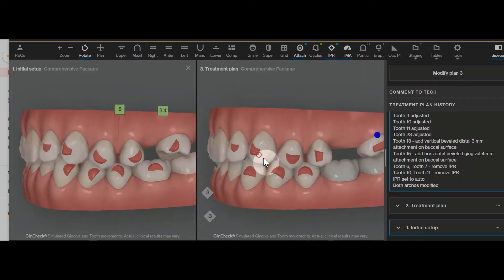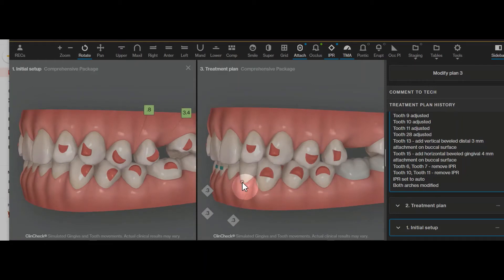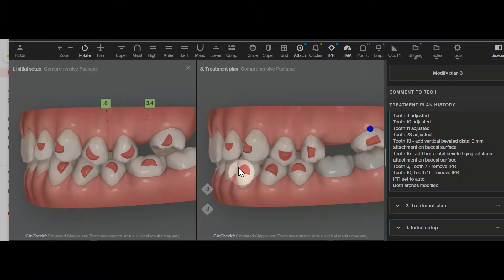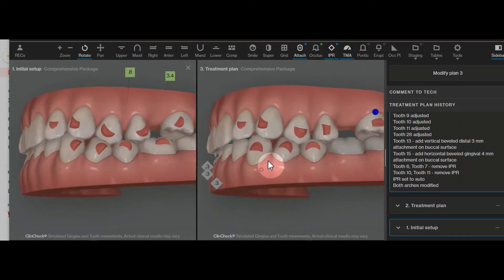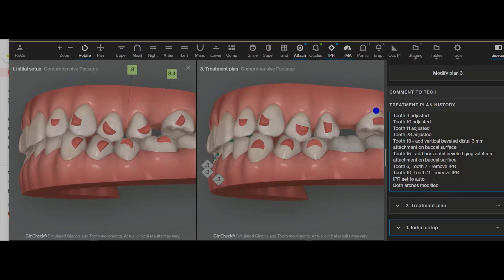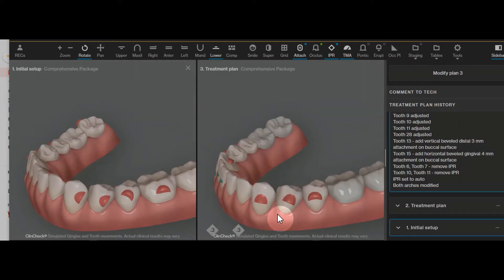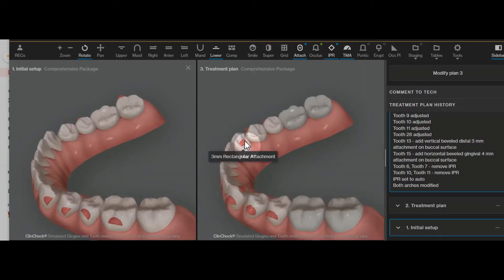We could delay some of these other attachments until this movement is done. If you and the patient don't mind, we can just place them all at once, and then the movement on just tooth 15 and the lower anterior are going to start first. The lower anterior movements are intrusion, which are generally more resistant from the bone but can occur easily and well if we have good retention attachments, which we do.